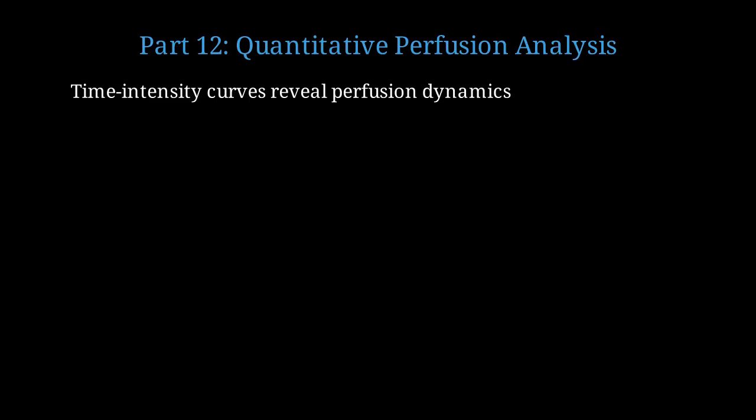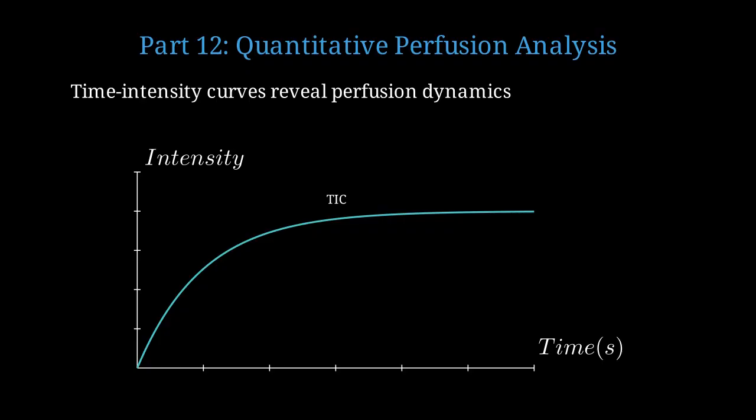Superresolution ultrasound enables quantitative measurement of tissue perfusion parameters. By analyzing how contrast intensity changes over time, we extract quantitative perfusion parameters. This time intensity curve shows rapid wash-in as microbubbles enter tissue, reaching a plateau representing steady-state perfusion.